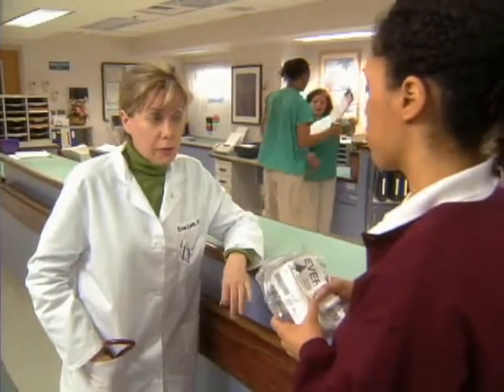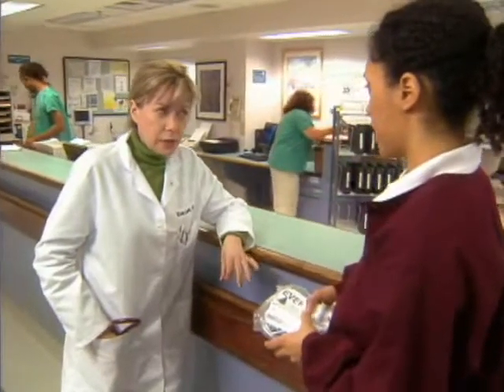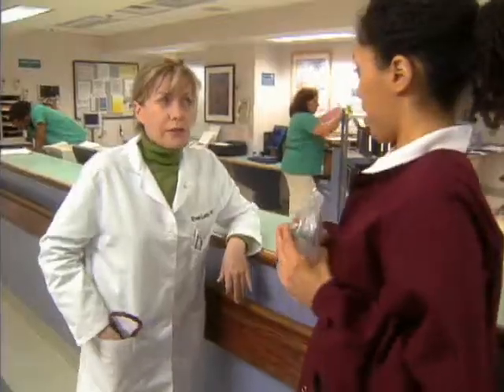Okay, that's fine. When you're putting it on, it's important to make sure that the mask fits snugly around the patient's face. If it's loose, it will not effectively deliver the right amount of oxygen. Right. And be aware of meal times because... Because the patient can't eat with a mask on. Exactly. So there should be an order for oxygen via nasal cannula during meals. But because the amount of oxygen with the cannula will be less than the mask, return to the mask immediately after his meal. Okay, should we go? Yeah, let's.